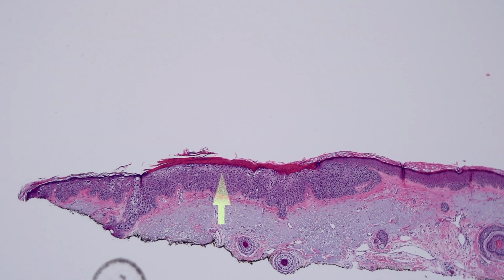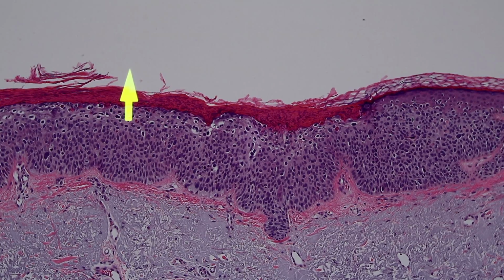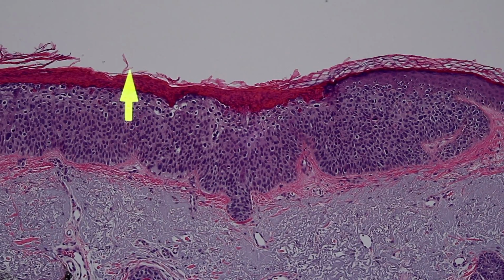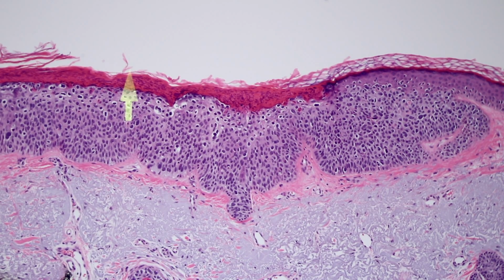And then look here, we've got a dense, thick band of parakeratosis. Again, even if you can't see the nuclei, you can tell probably it's going to be para. And of course, look, massive amount of sun damage. If you're thinking something might be actinic keratosis, but you don't see any solar elastosis, maybe take a step back and rethink that, because usually when I make a diagnosis of actinic keratosis, there's solar elastosis underneath. And if I don't see that, then I wonder, could this be something else that's causing the keratinocytes to look atypical? And the same is usually true for squamous cell carcinoma in situ, although sometimes you do see it outside the setting of sun damage.